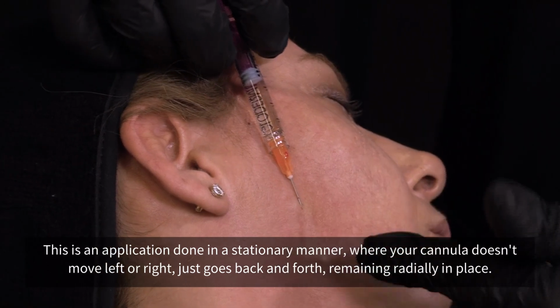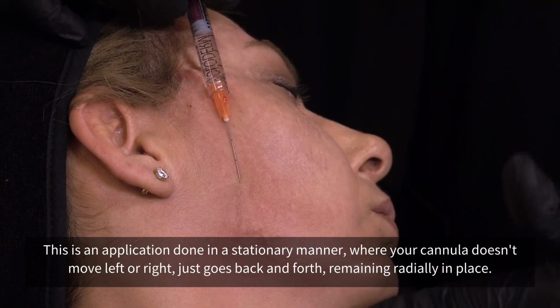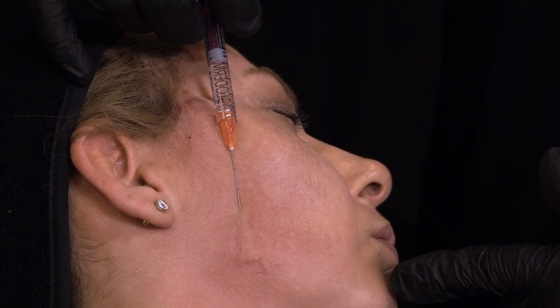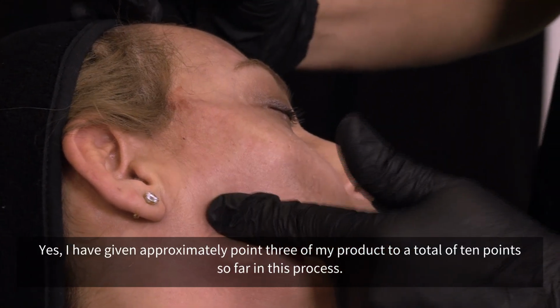This is an application done in a stationary manner, where your cannula doesn't move left or right, just goes back and forth, remaining radially in place. Yes, I have given approximately 0.3 of my product to a total of 10 points so far in this process.